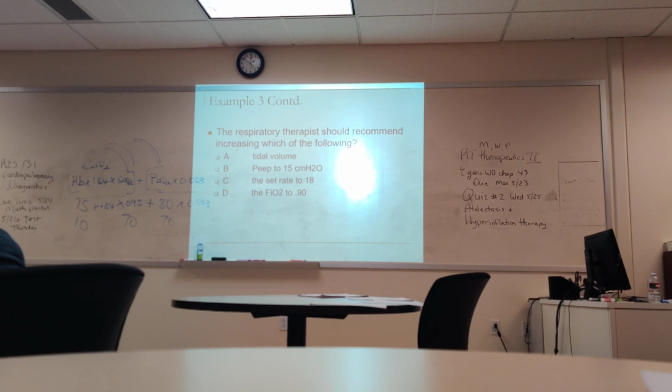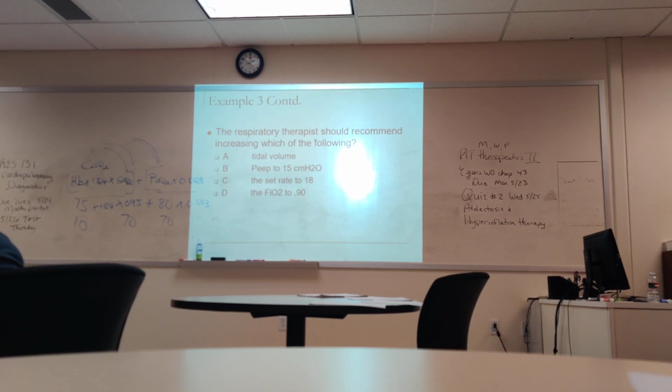What are we going to do here to give them more oxygen? What do you think, Brian? B. B? Yeah. You're going to increase PEEP. You keep on increasing PEEP until you get the PaO2 that you're looking for, or you have a side effect.